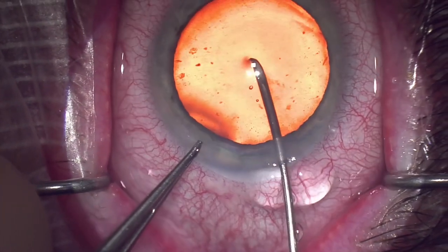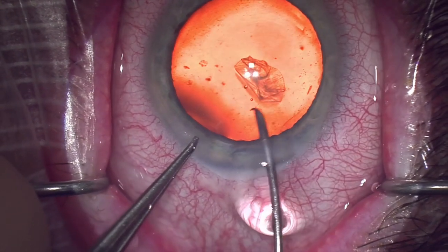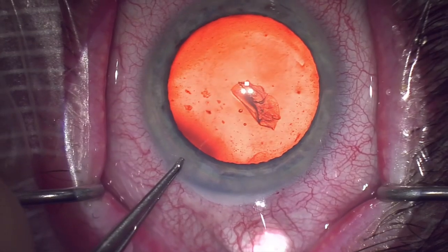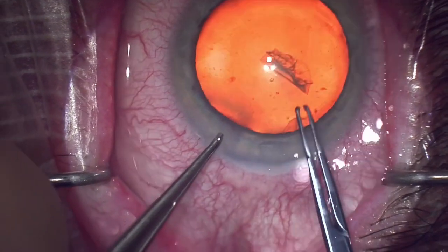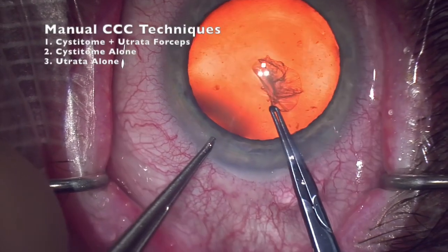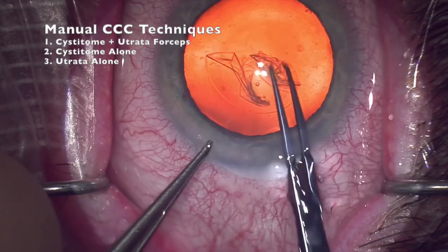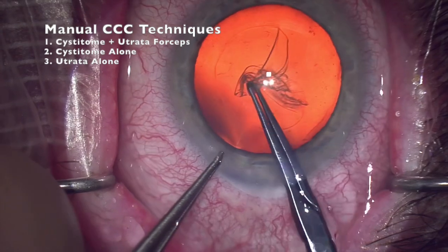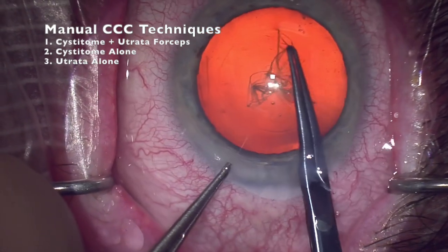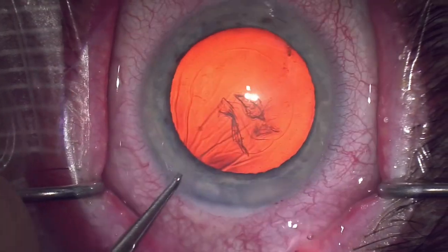There are many ways to perform a capsulorexis. I prefer to start out with a cystitome and then move on to using Utrata forceps, but I do have colleagues who use a cystitome for the entire capsulorexis. And I'm sure you've seen videos where some colleagues will use a sharper Utrata to pierce the capsule and then carry on performing the entire capsulorexis using those Utrata forceps.